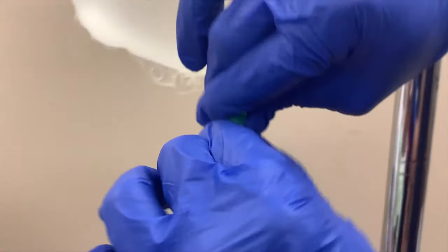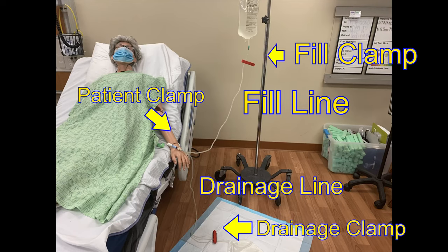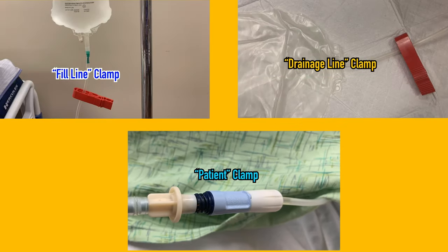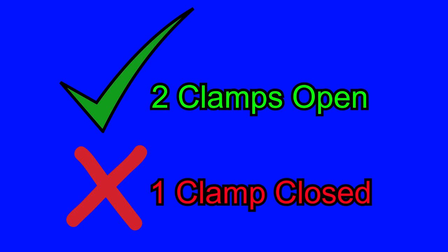Now break the green frangible located directly beneath the dialysate bag. The completed setup will look like this: the fill clamp is on the fill line and stops fluid from draining from the dialysate bag; the drainage clamp is on the drainage line and stops fluid from draining into the drainage bag; the patient's clamp connects to the UltraBag system. Each stage of peritoneal dialysis requires different clamps to be open or closed. You'll be working with three clamps: the fill line clamp, the drainage line clamp, and the patient clamp. Before you begin any stage, ensure that all three clamps are closed. During each stage, two clamps will be open and one will remain closed.